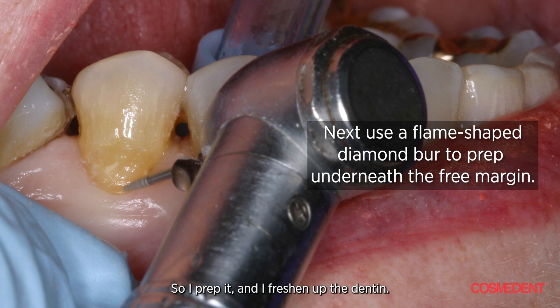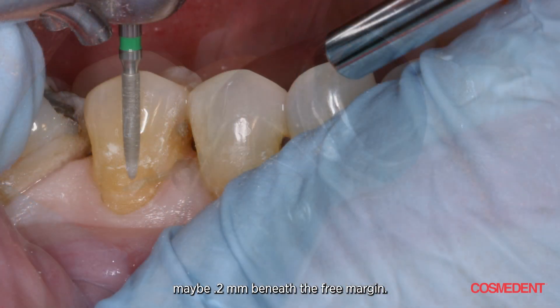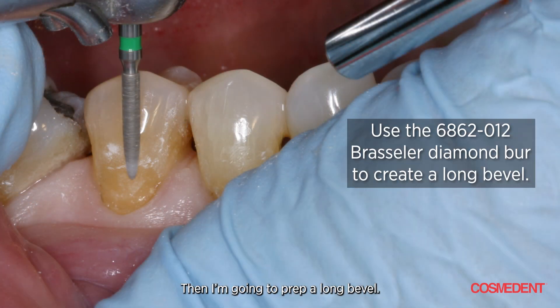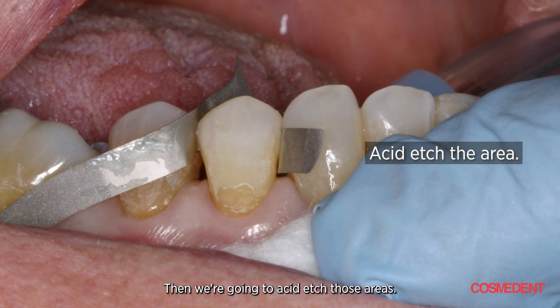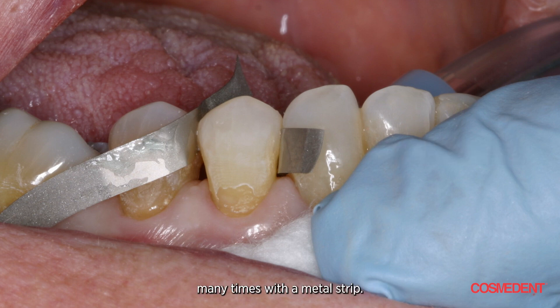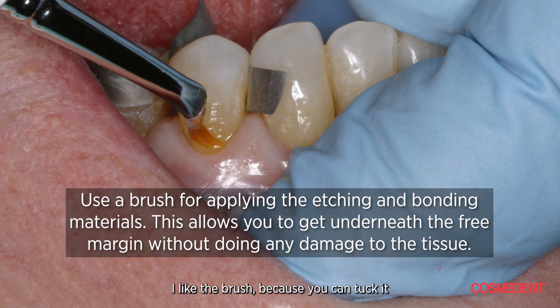I prep it and freshen up the dentin. You can see the dental margin is now just slightly — maybe two-tenths of a millimeter — beneath the free margin. Then I prep a long bevel, clean and neat. You can see the length of the long bevel. Then we acid etch those areas. I'll isolate many times with a metal strip, and after I acid etch, I apply the bonding adhesive.